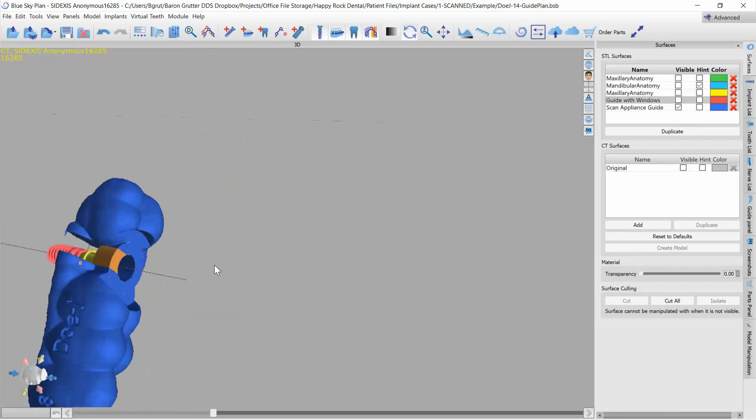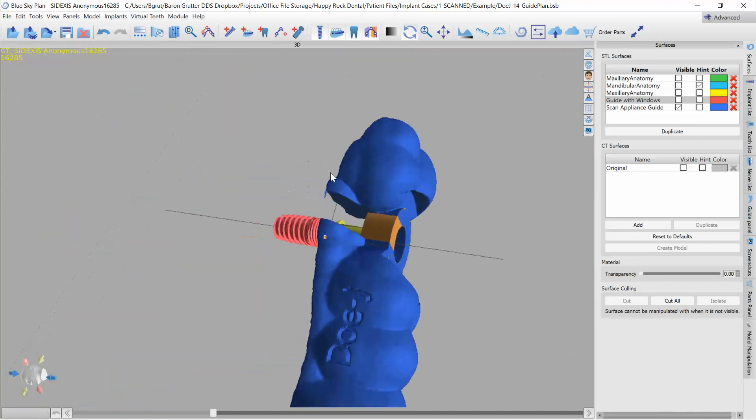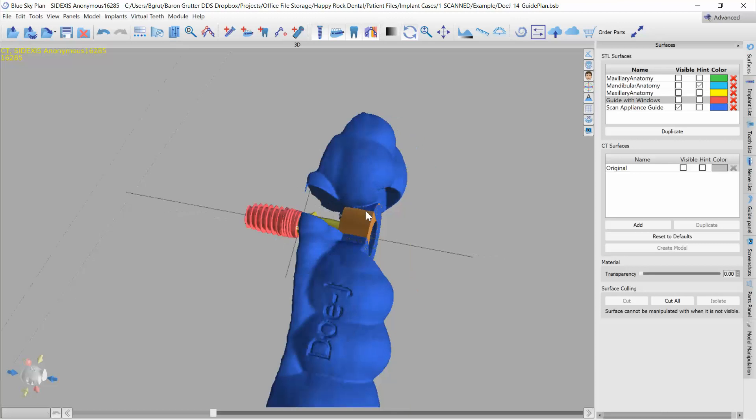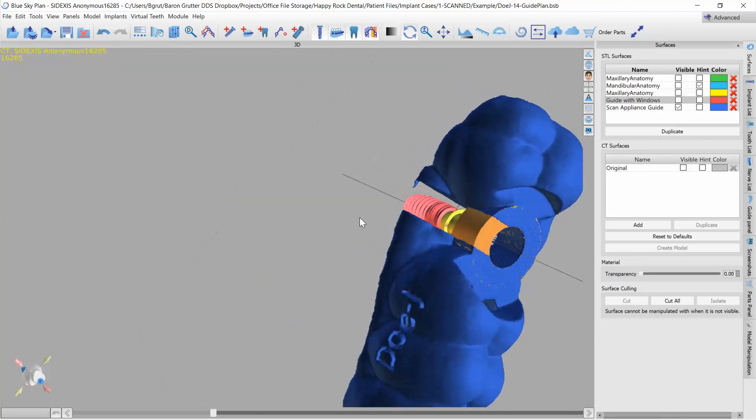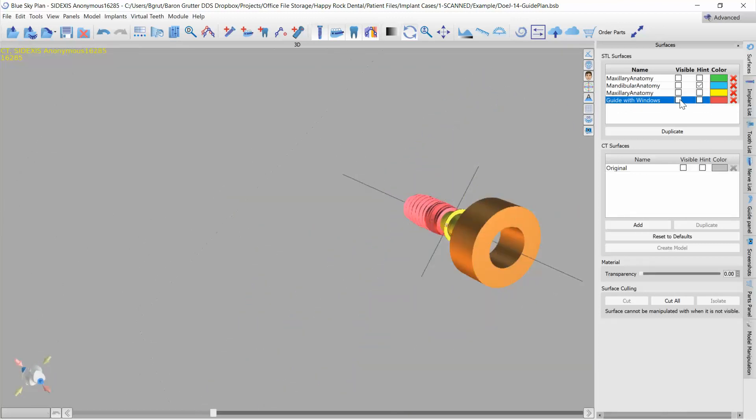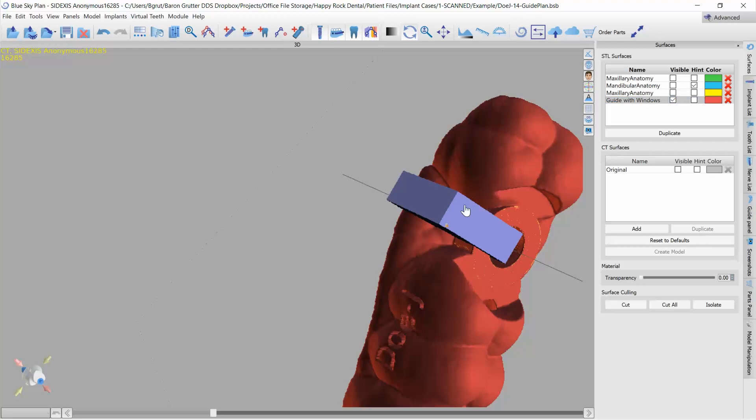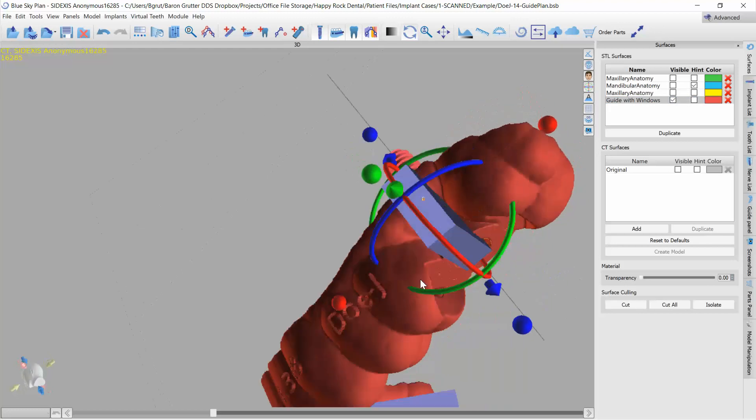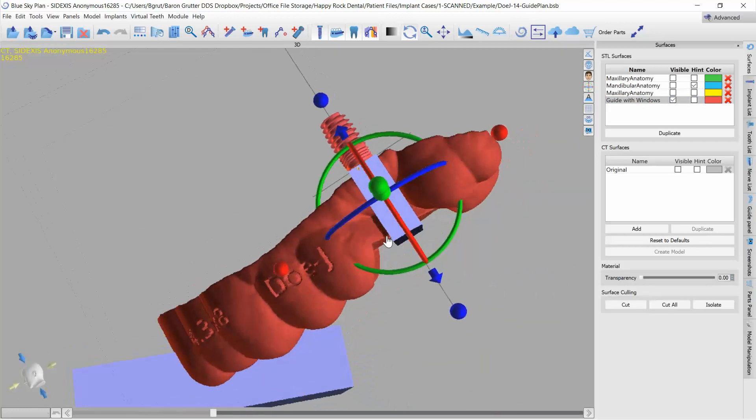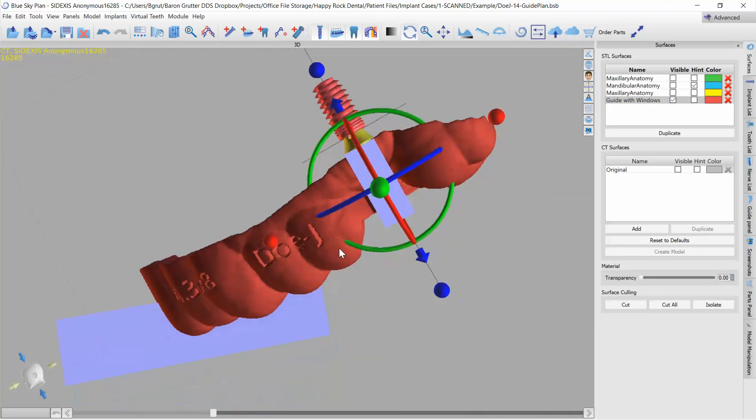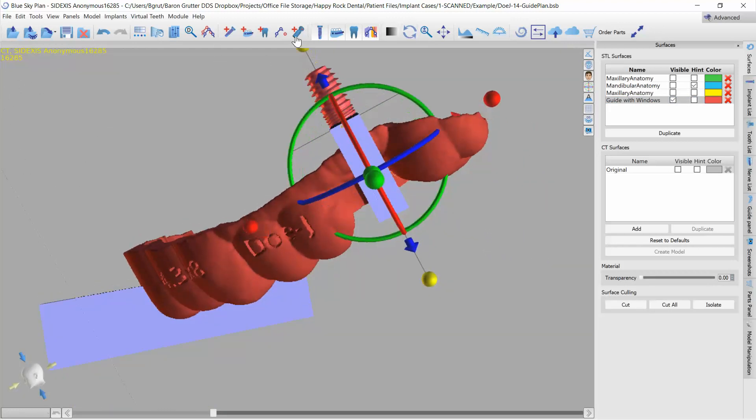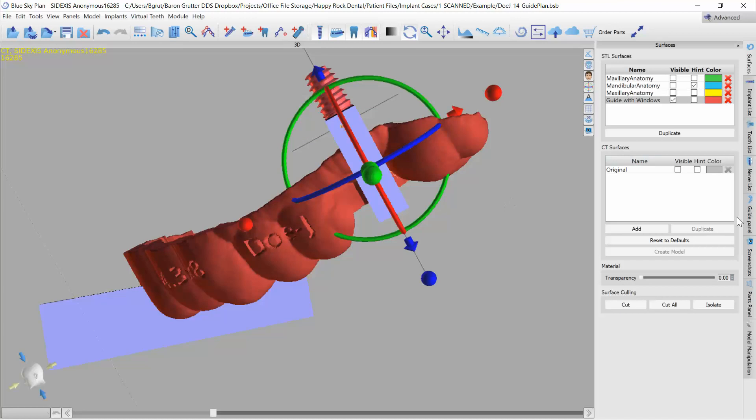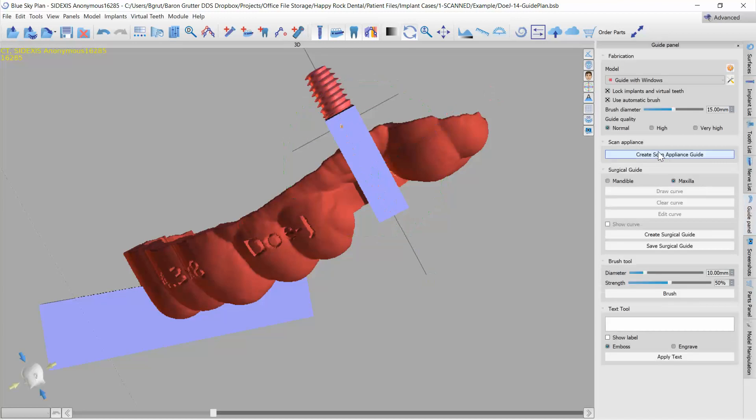Now I do notice there's these little tags here because I wasn't careful when planning the size of it. So I'll show you what I mean. I didn't make sure that it extended all the way below it. No big deal, just do that now, go to guide panel, create scan appliance guide again, and that should make a full cut.